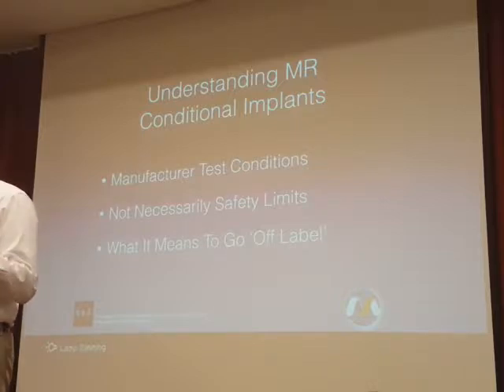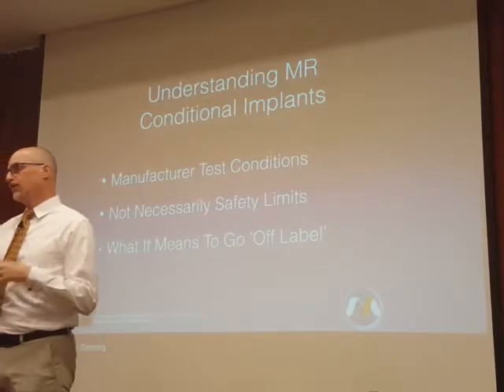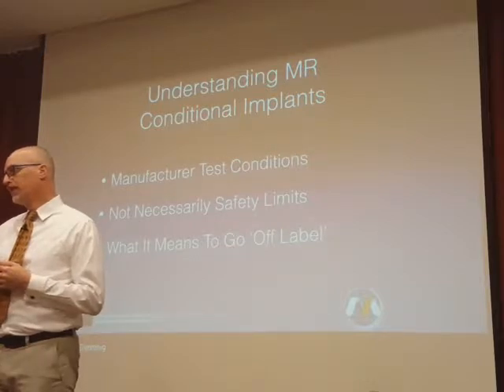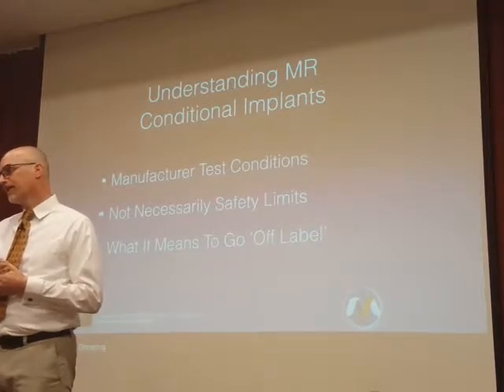I suspect that that kind of technology is going to spread into all kinds of active implantable devices, neurostimulators, ICDs. Because one year ago I faced the neurostimulator for that.